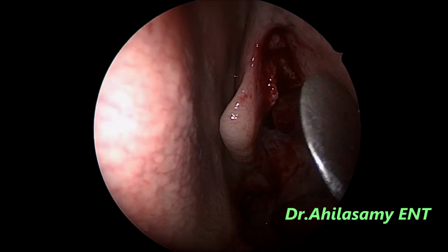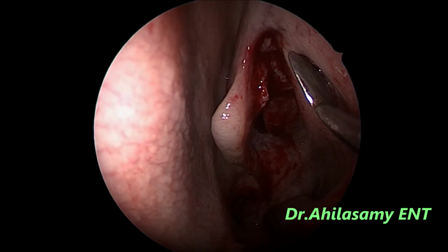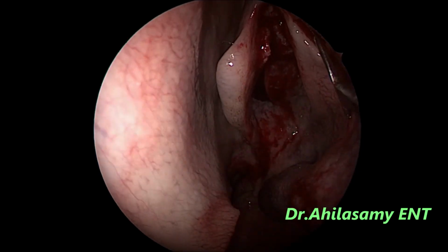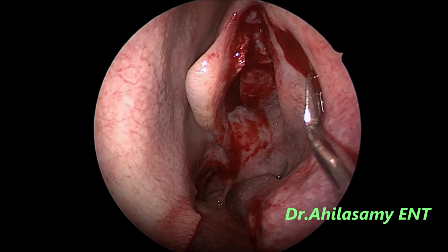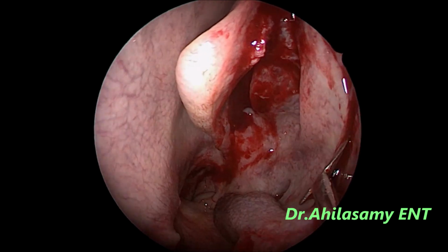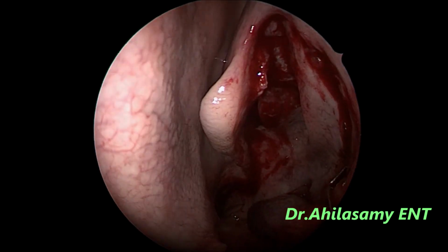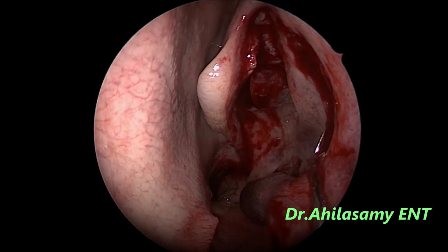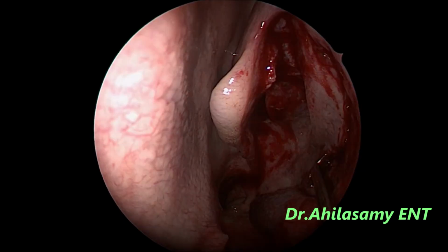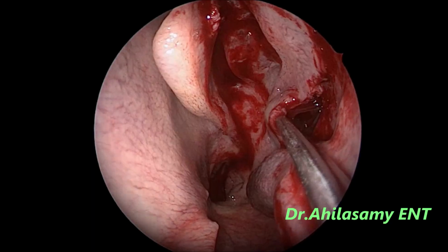Now I am using Dr. Ahila's, my innovation, uncinate dissector. It's a very beautiful tool. You should have one in your rack or in your tray. You can very beautifully dissect the uncinate. In one stroke, you can dissect the whole uncinate and go into the maxillary sinus. Again, appreciate hardly any bleeding under local anesthesia and the field quality.